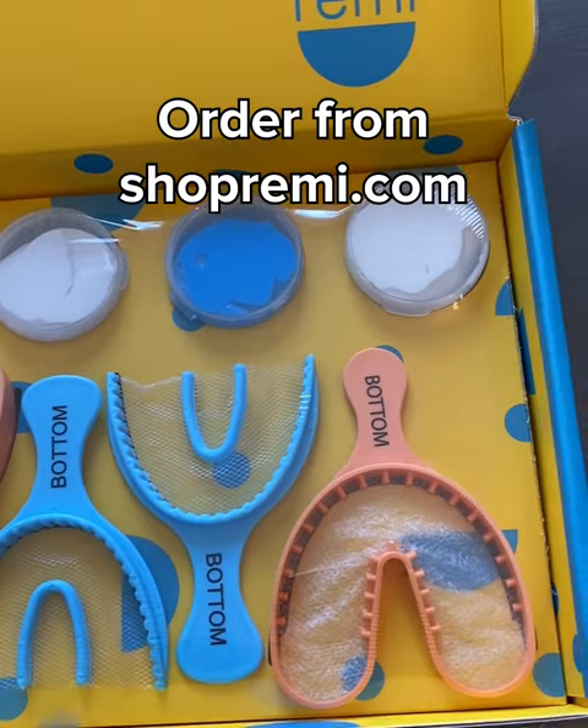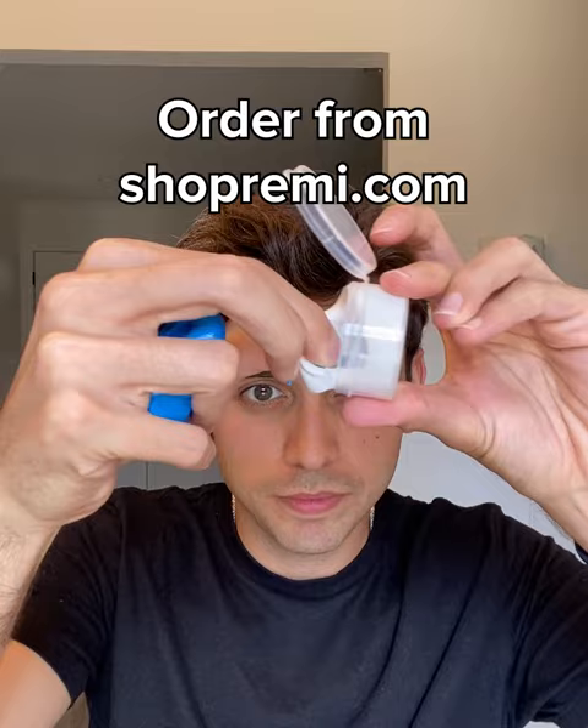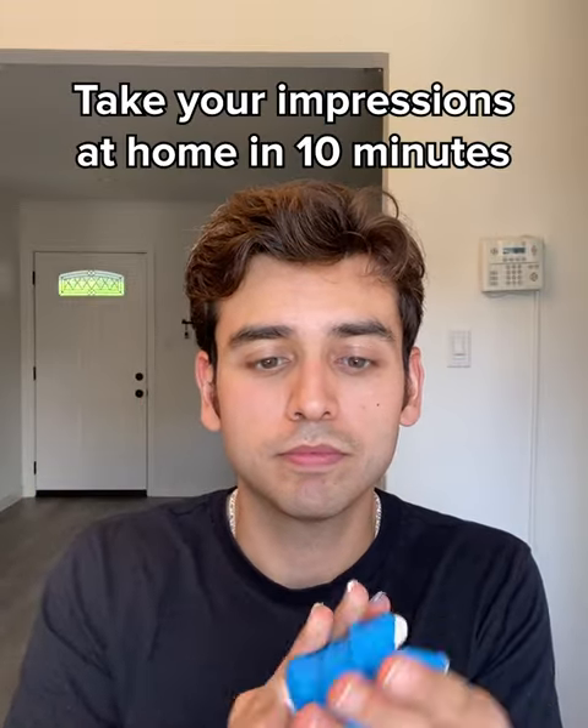Here's how I got mine. You order the impression kit at shopremie.com and receive it within two to four business days. Then you take your teeth impressions. The whole process, by the way, takes 10 minutes and it's pretty fun. The impressions themselves take about five minutes to make.